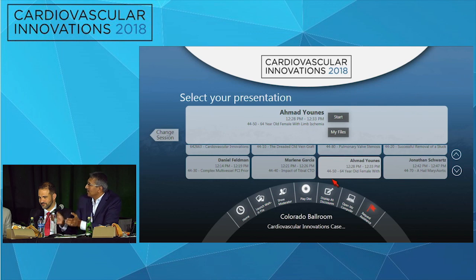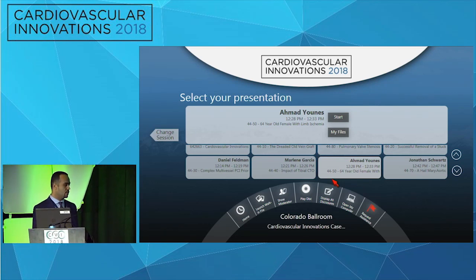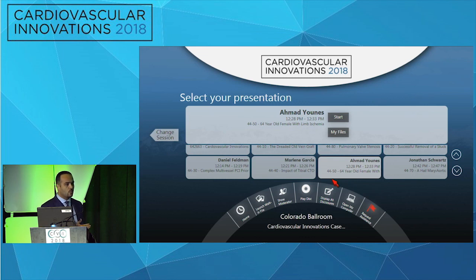Because the stents are proximally occluded, and it would be much easier to think about it. Our very high suspicion was that this would be thrombus, and we were anticipating we'd be using bulky devices, mechanical suction devices. We may need 8 French, this was an 8 French. And at some point, you can maybe use Inari devices, which is a 22 French. Doing all of this radially or brachially will be very challenging. So we went with our gut feeling that we were going to need large gizmos to get over this.